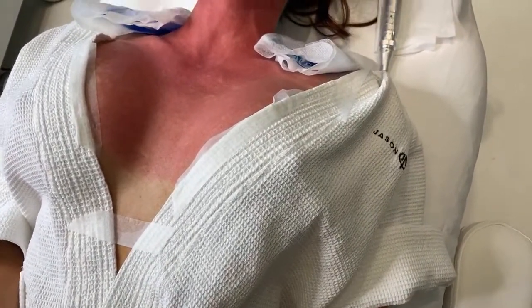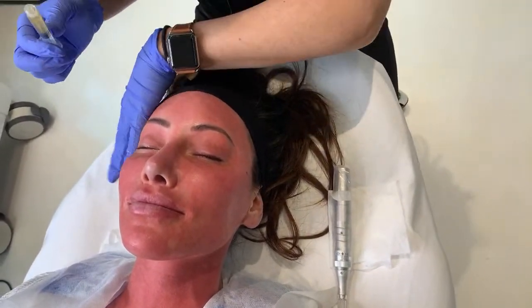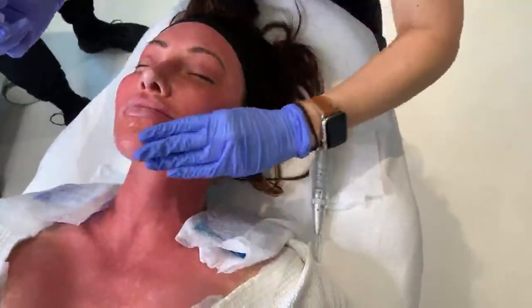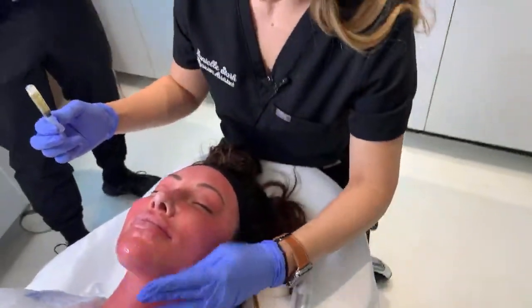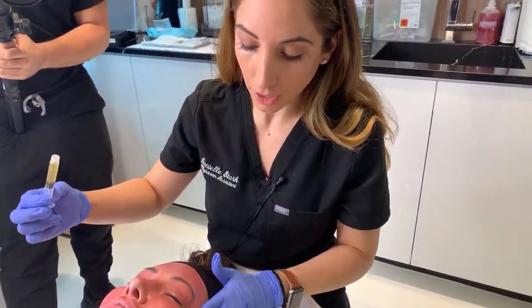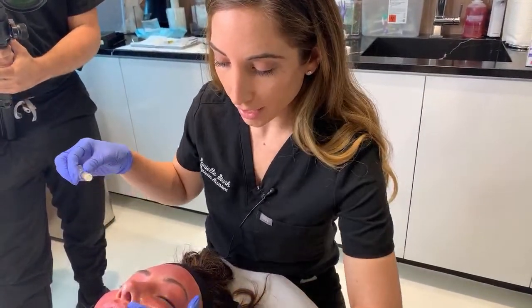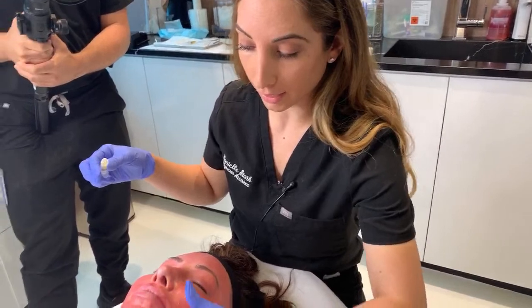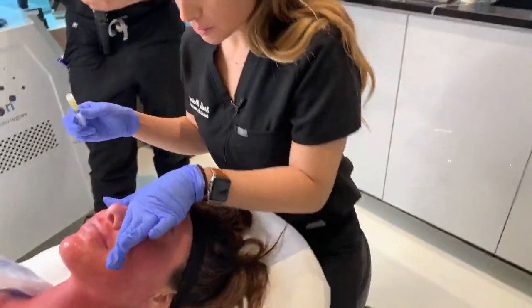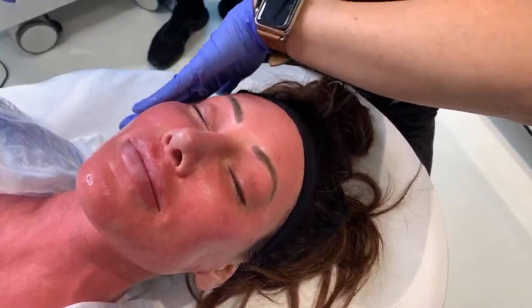What I'm doing now is applying topical PRP. So we use a number of serums and PRP to promote healing and hydration after this type of treatment. And what we're going to finish off with is a microneedling. So it's not going to be a very deep microneedling treatment. It's just going to be enough to make some tiny little holes in the skin and allow this to really sink in and be absorbed well by the superficial layers of the skin as well as slightly deeper. So that's what we're using right now, and I'm just really gently spreading it all over.